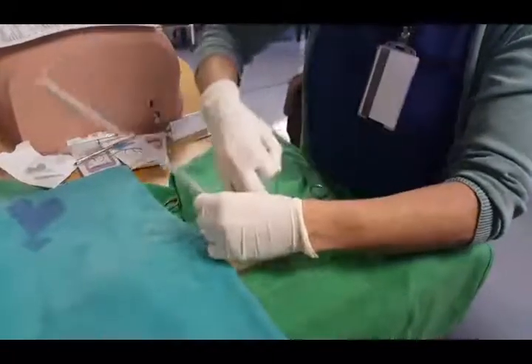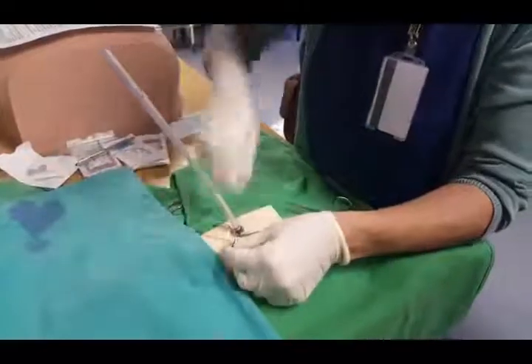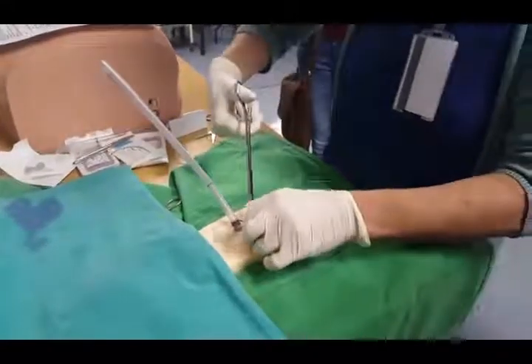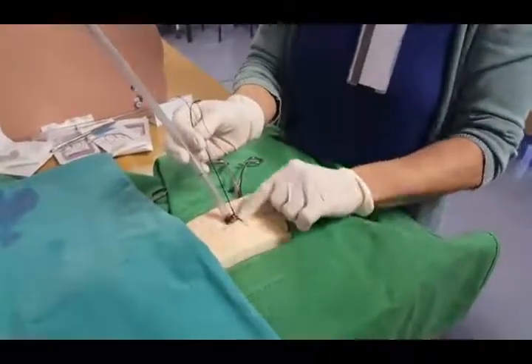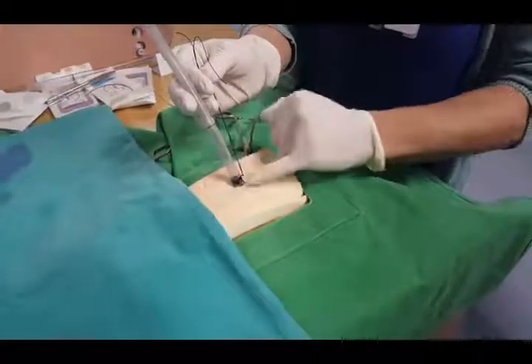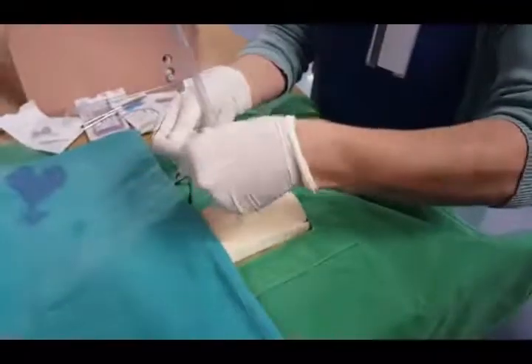Then what you want to do is take it around and around until you've got a little bit left before the knot, so that the knot's on this side of the suture. This is to basically anchor it in — using this as an anchor. It also gives you a space to cut when you're taking the tube out, without going through the actual anchoring portion, so that you've got something to tie up afterwards.